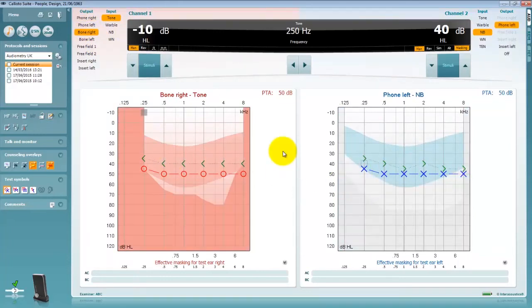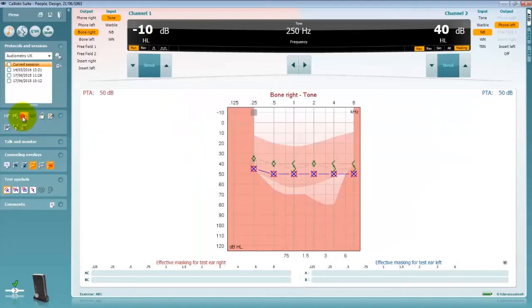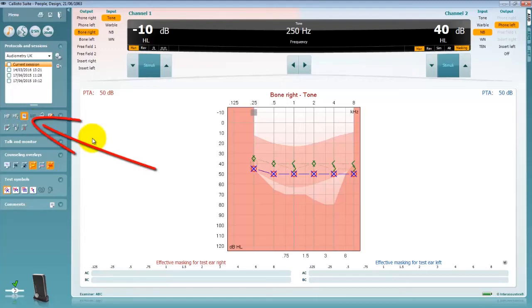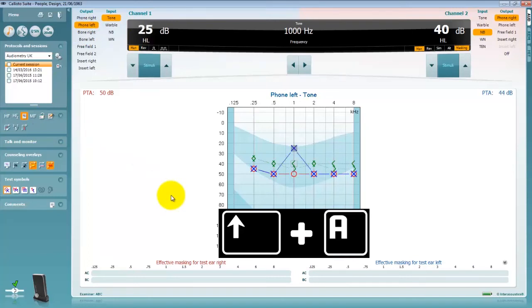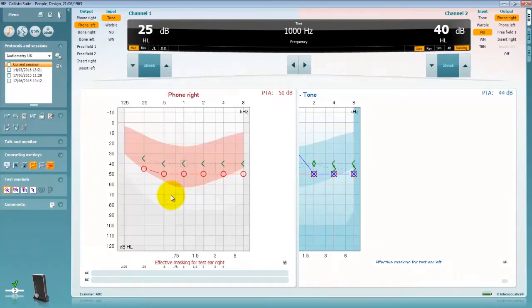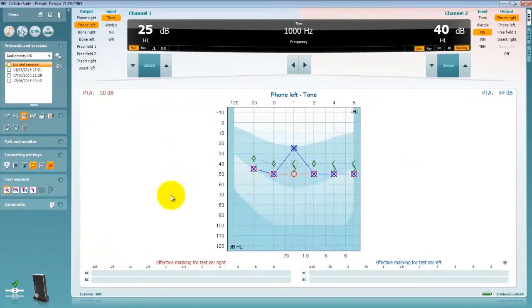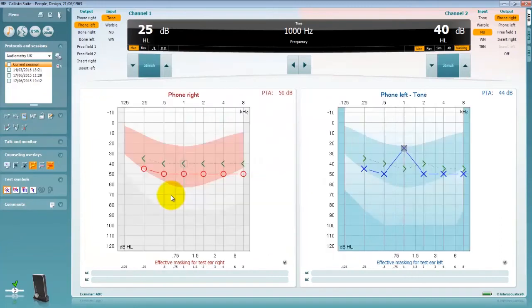As default your system may be configured to display the audiometry in two graphs one for each ear side. However you can click on this icon or press the shortcut shift and A to display both the right and left ear data in one graph. This is useful when determining which ear to mask and how much masking to apply.